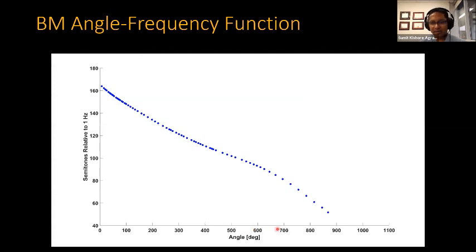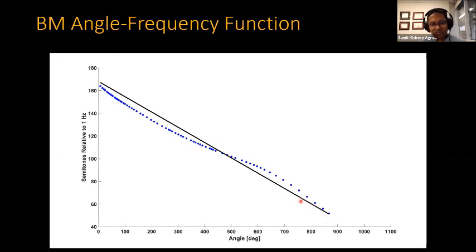So now we're going to come back to our data. And now we've changed the y-axis to be the semitones, and the x-axis is, again, the angular insertion. And this is our smaller cochlea. We could do a simple linear regression, and it's not a bad fit, but you can see there's still this sinusoidal pattern that we haven't accounted for.